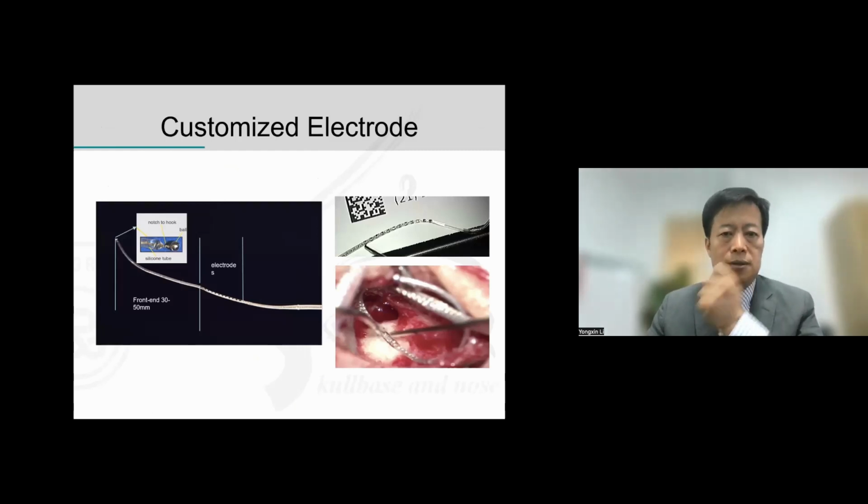Let's see the custom electrode. This was designed by the MED-EL company, and this part belongs to the electrode. So this is easy to enter the cavity, so the doctor can insert this.